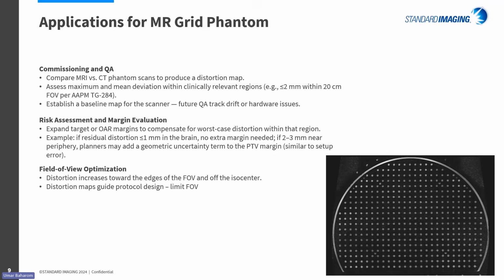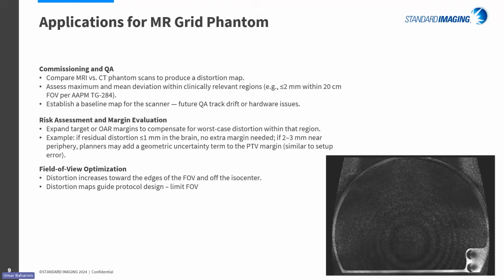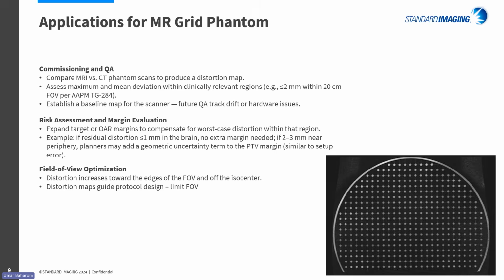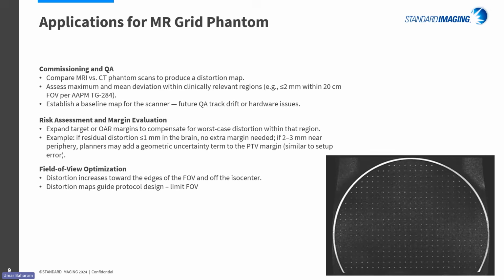Field of view optimization: like I said, distortion increases towards the edge. So if you see a lot of distortion, you may want to limit your field of view during the scan.